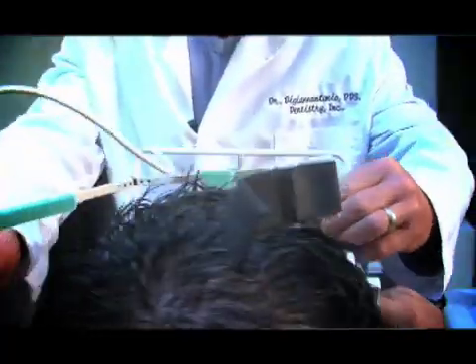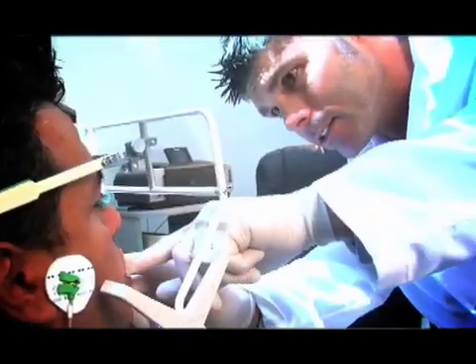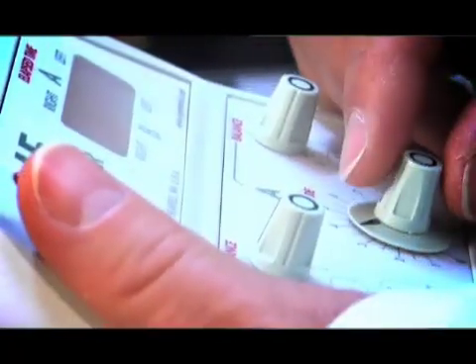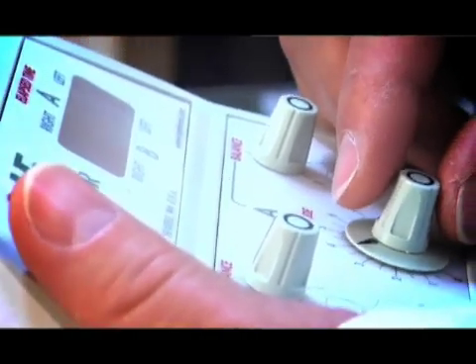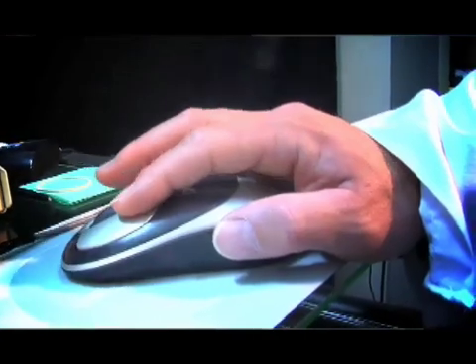So by using computerized instrumentation, I'm able to then record muscle activity. I'm able to actually listen to the joints through what we call sonography. So now I have a pretty clear understanding of if there's any pathology or disease going on in the actual joints. And then I'm able to actually scan the mandible in real time with simultaneous EMG or joint activity and see where that mandible wants to position itself.